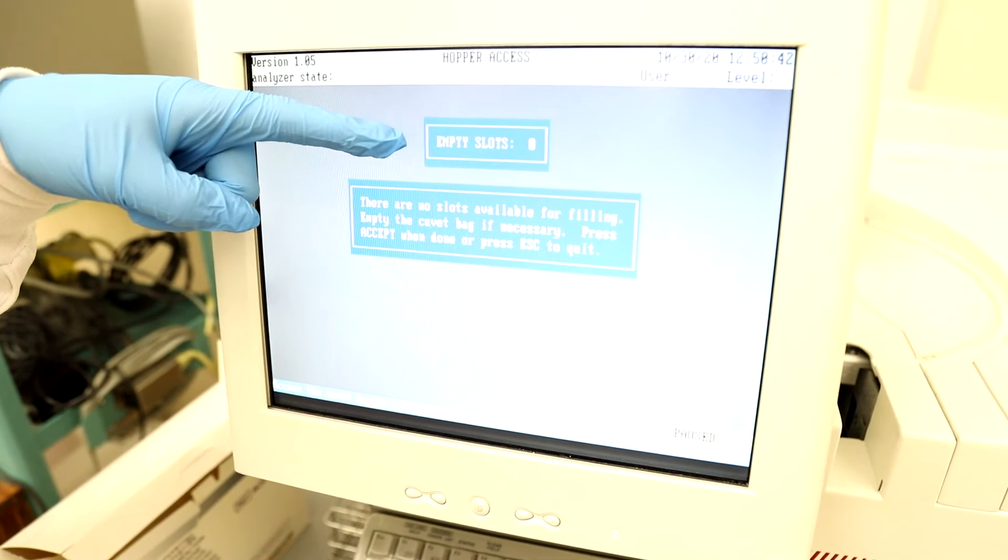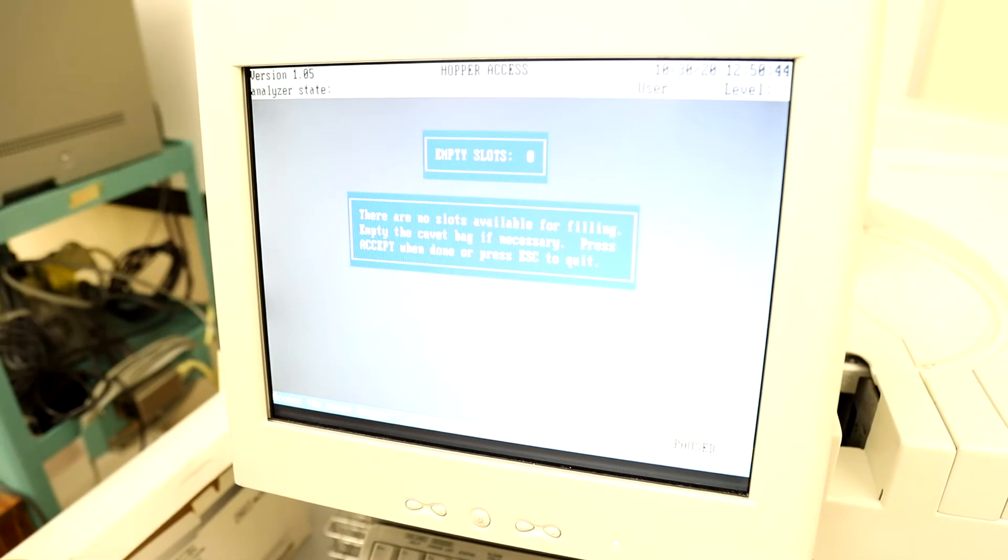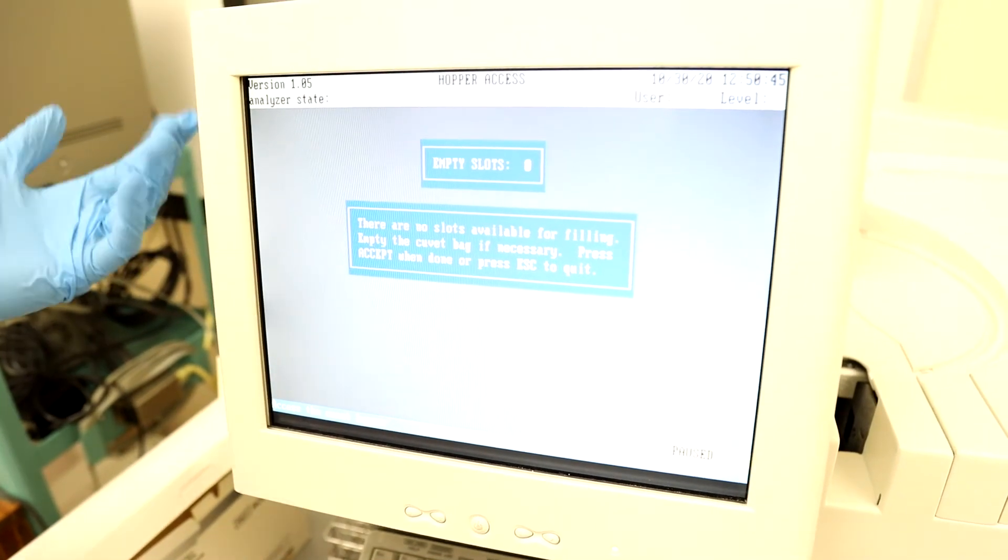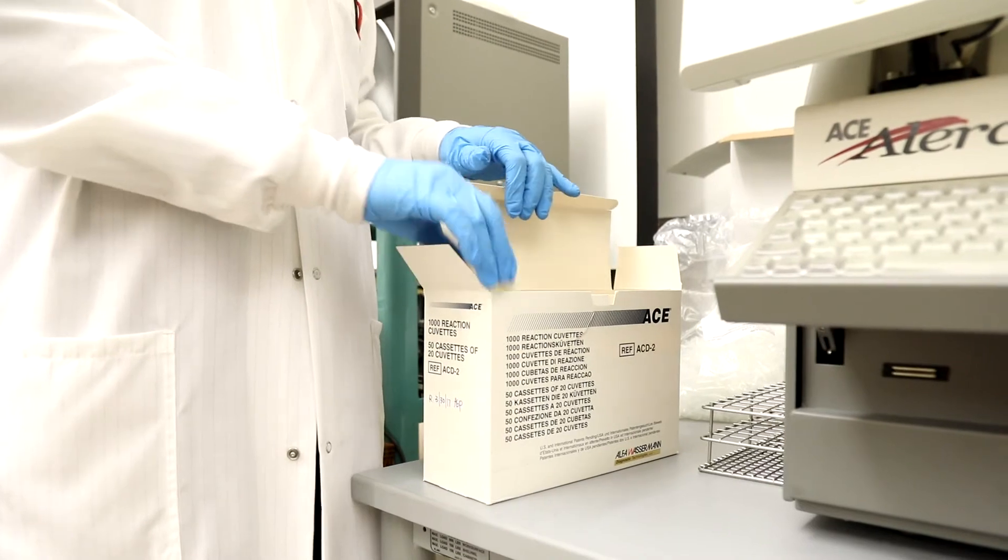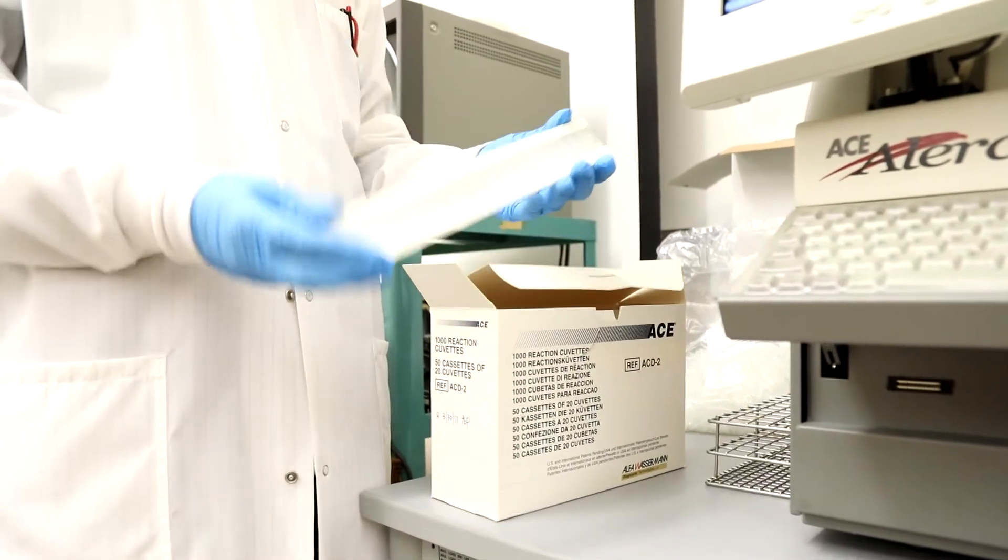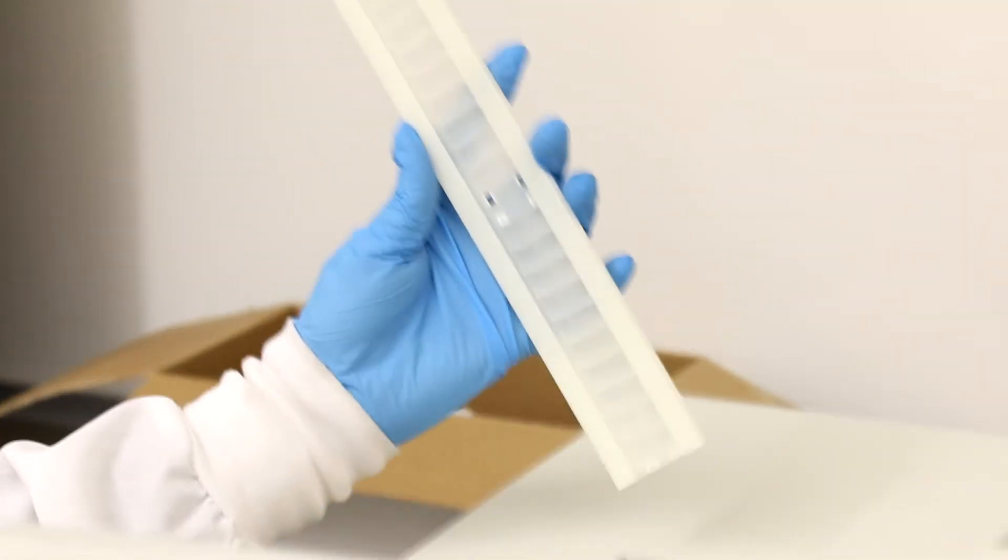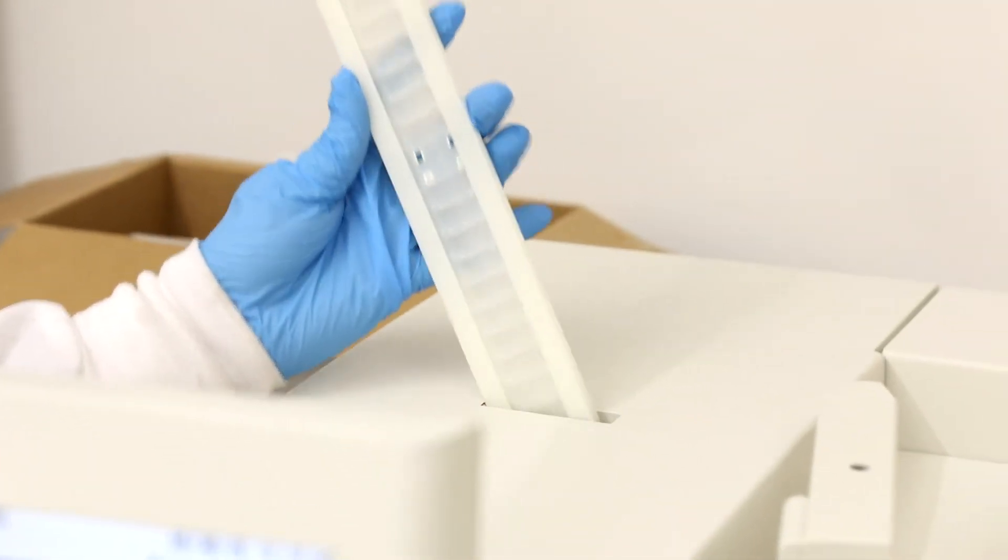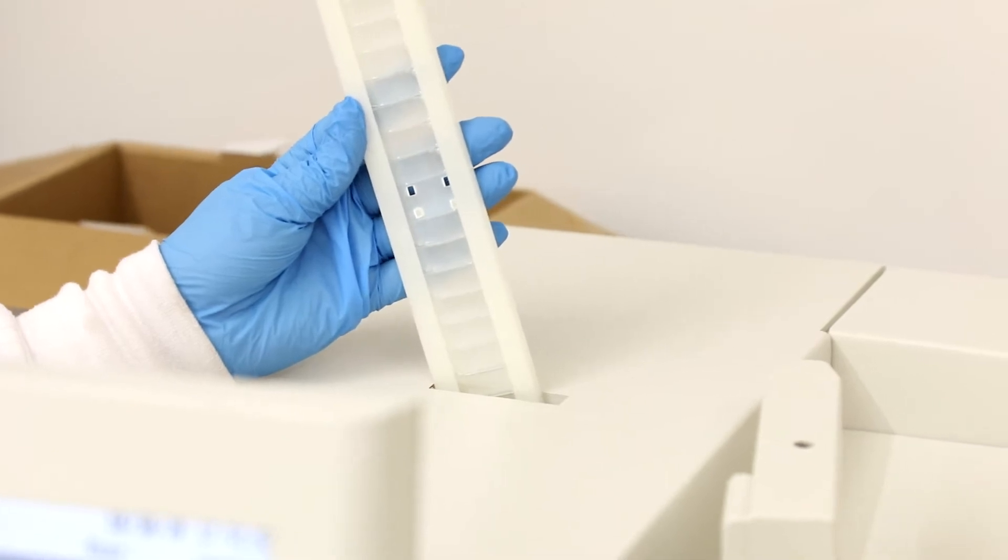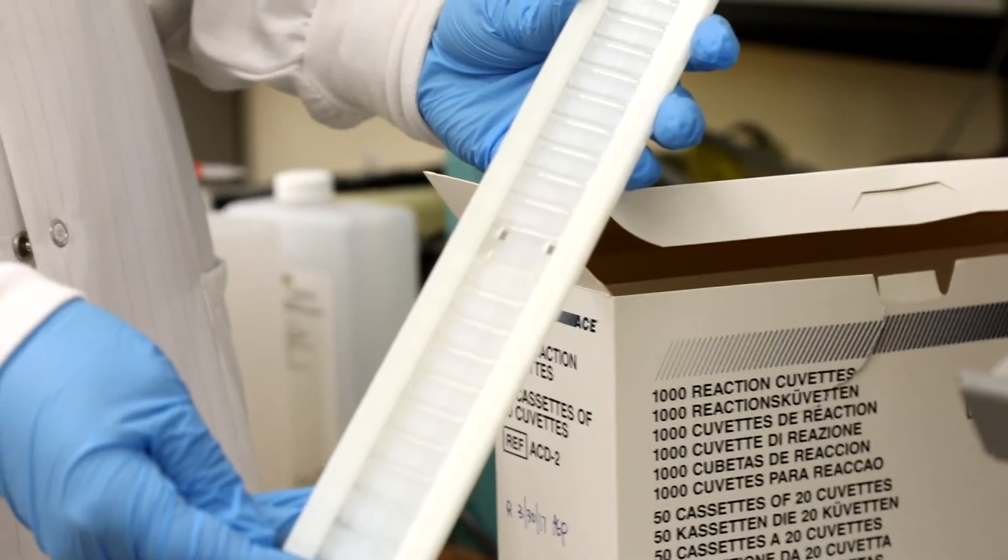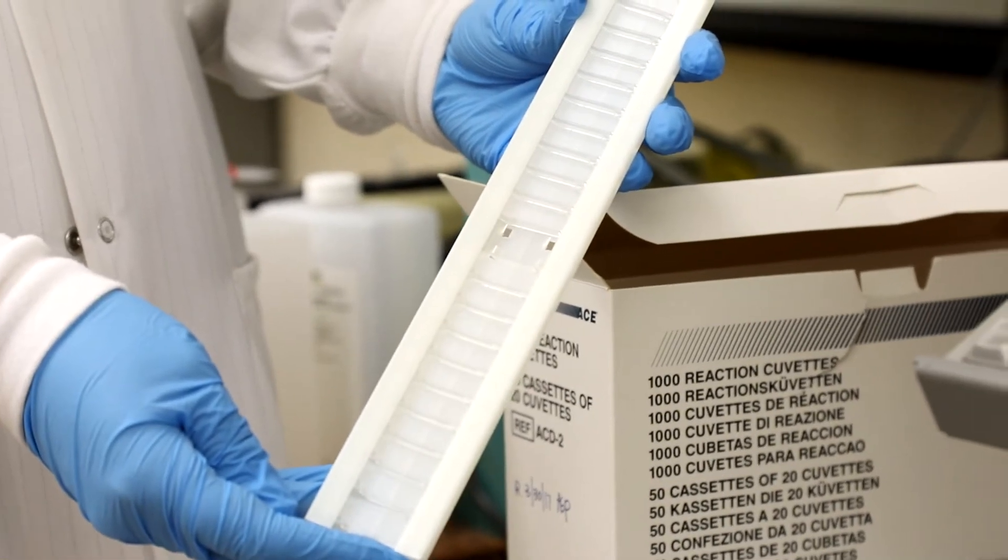The screen will then bring up how many empty slots need to be filled. To load the cuvettes, you will insert a sleeve at a diagonal angle with the cuvette side facing you. Press down until it clicks and then pull the sleeve out. Load the cuvettes until all the slots are filled.